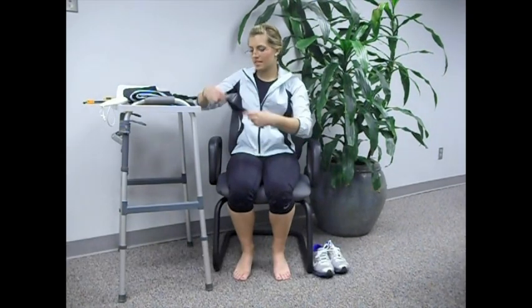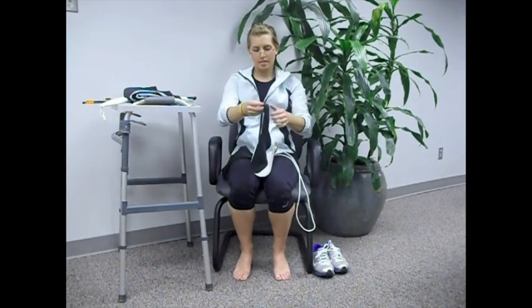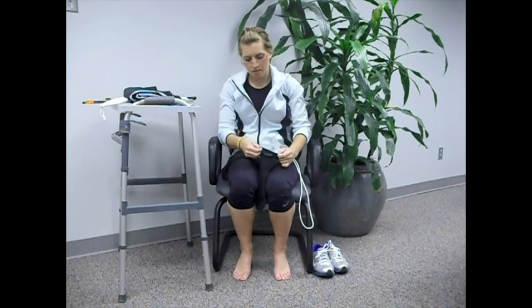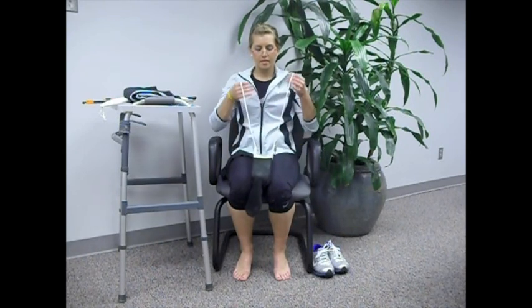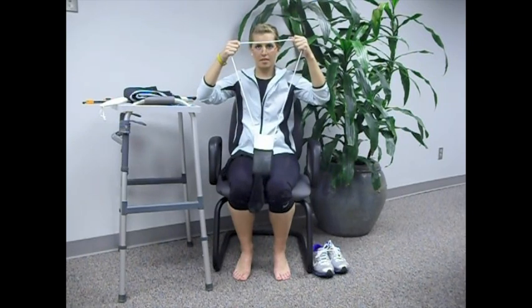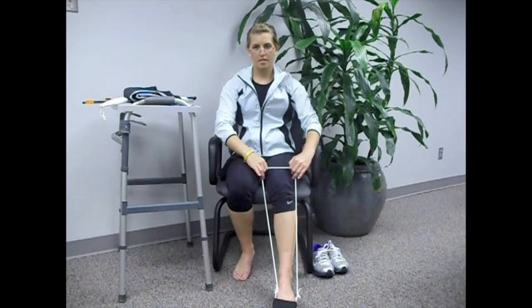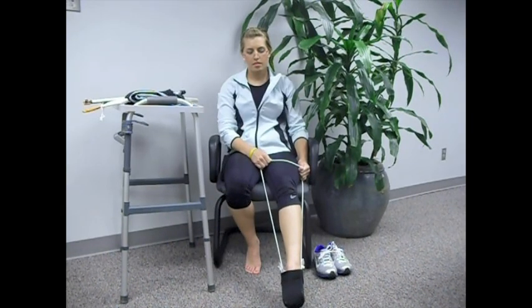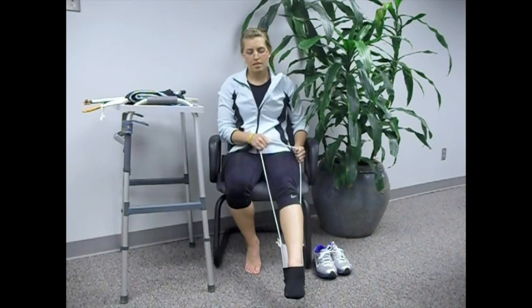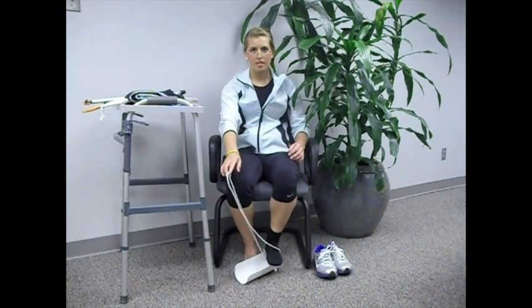We begin with putting our socks on. First, we're going to get the sock aid off of the walker tray. We will put the sock over the tip furthest away from the rope ends, then pull the sock up the sock aid. Then we will place the sock aid on the floor in front of the operated leg. Now we are going to insert the foot of the operated leg into the sock aid and slowly pull up with the sock aid, letting the sock aid do the work. Just like that. Take the sock aid off of your operated leg, and we are dressed.